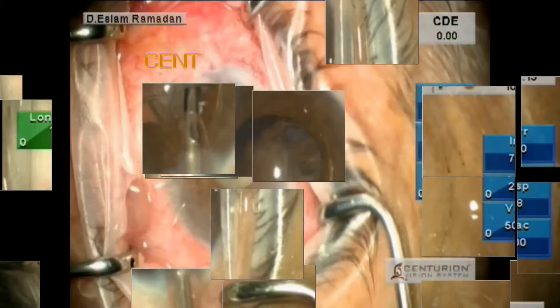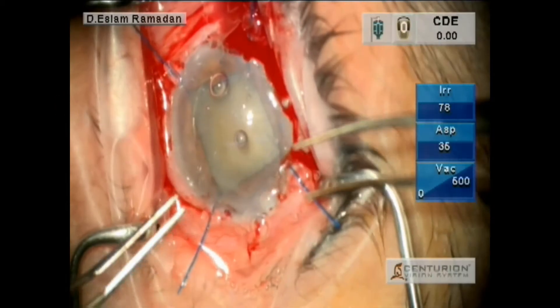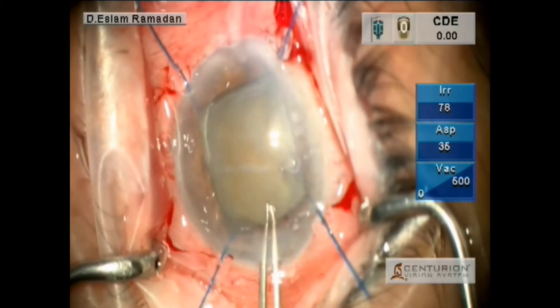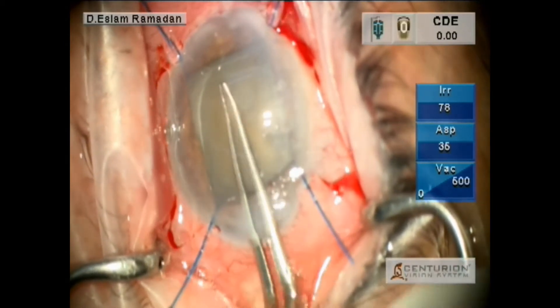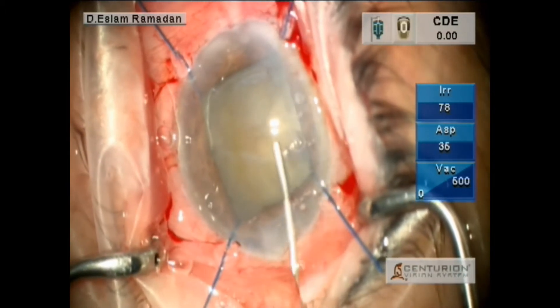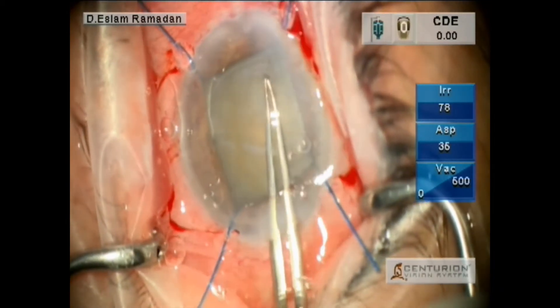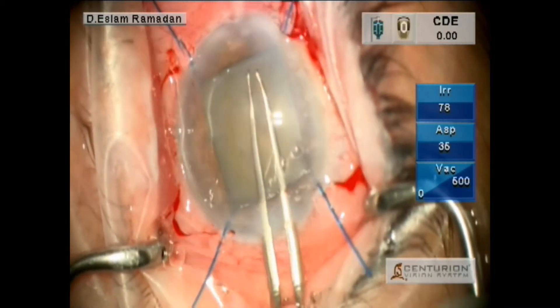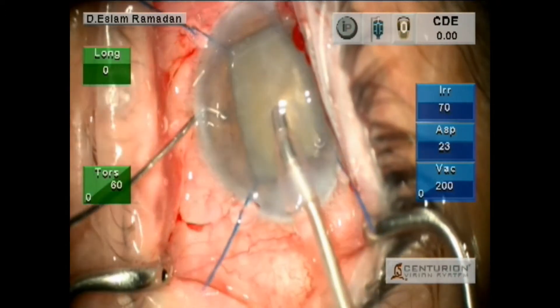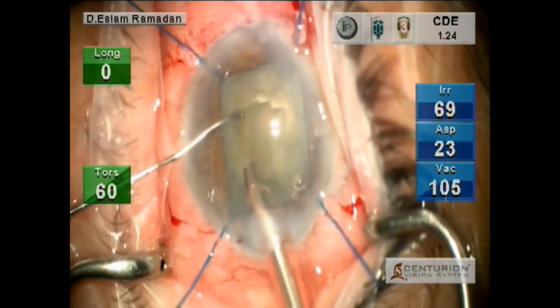So there is a big difference between the two machines. Now the second case is comparing the two machines in pseudoexfoliation hard cataract. After dilating the pupil with iris hooks, doing the capsulorhexis. As you can see, if you can see the capsulorhexis edge you can just complete it without staining. Doing the sculpting — central sculpting.